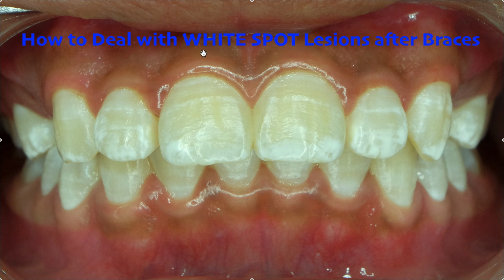Don't expect it to look perfect, which is why, again, I want a general dentist to do it, because sometimes we're gonna do this and then afterwards we're gonna put a thin veneer on, snap a restoration, maybe a thin layer of composite over it, just to kind of make it look better. So definitely it should be used in conjunction with some restorative treatment for the most part. And I think that will definitely help. So just, things to keep in mind.